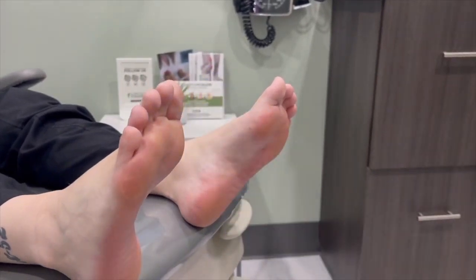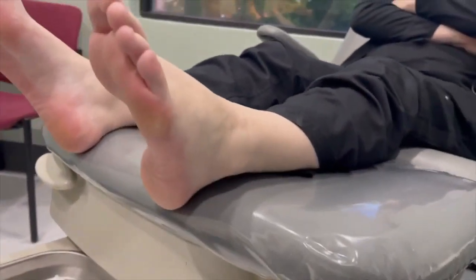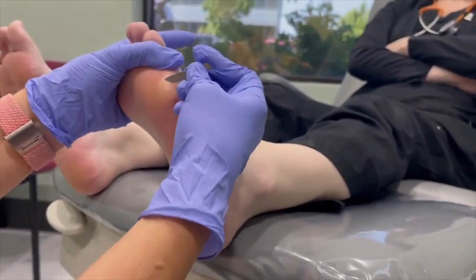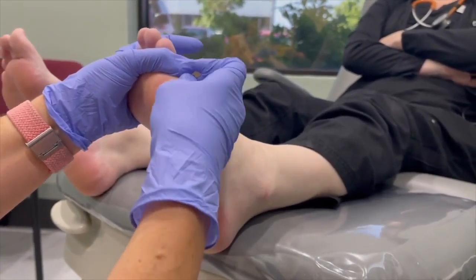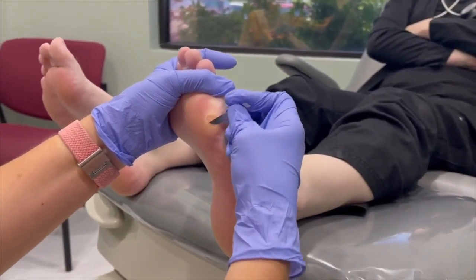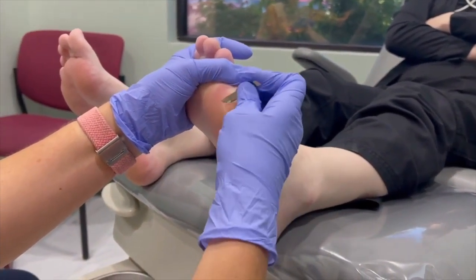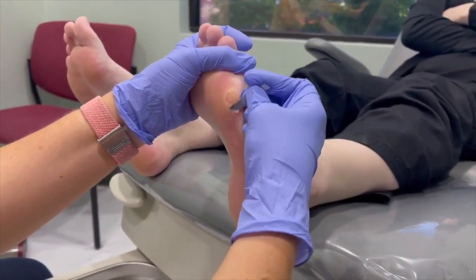All right, 1 down, 1 to go. You want to come on around. Perfect. This one's a little bit worse, and that corresponds to the arch in her foot. I feel like this is your bad foot, correct? For those of you who could not hear her head shake, she did say yes. I'm surprised this doesn't hurt.